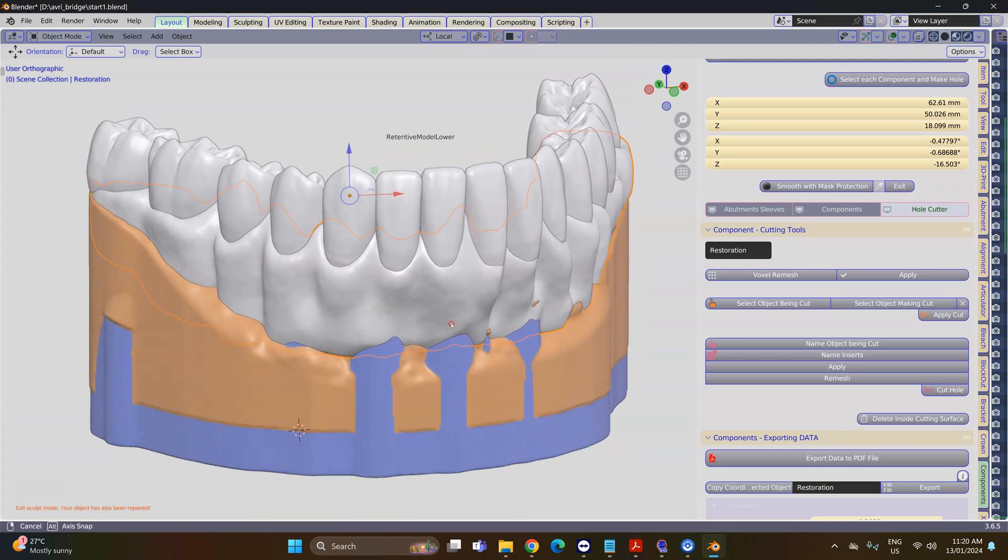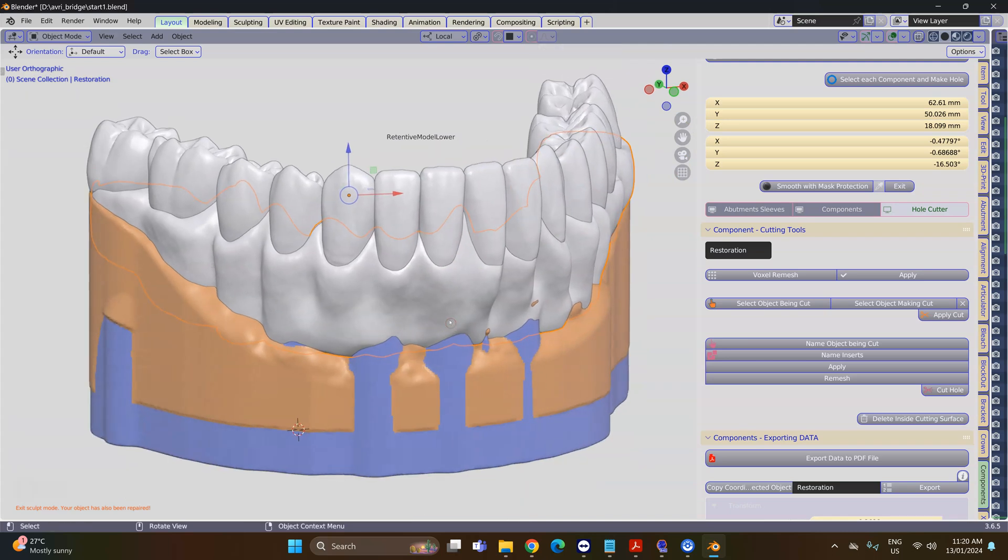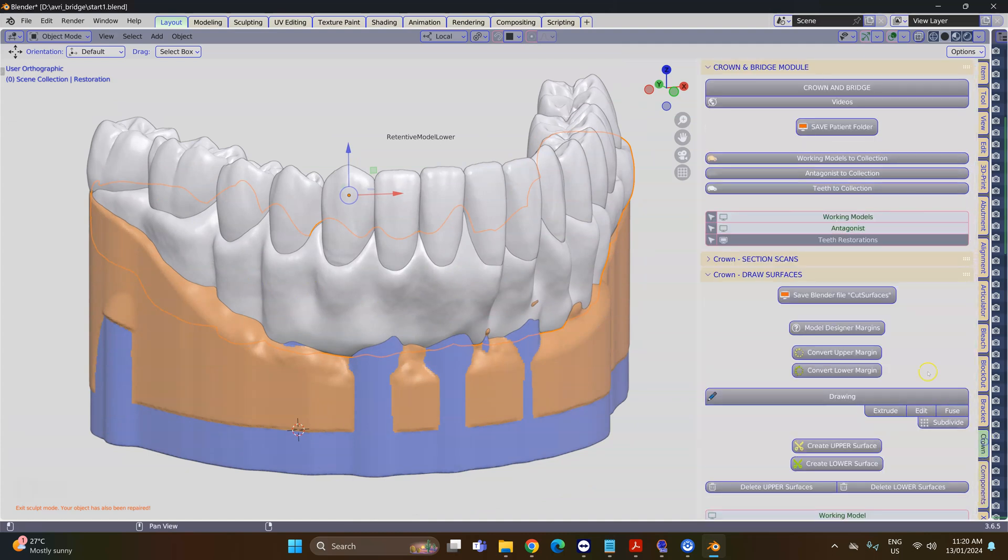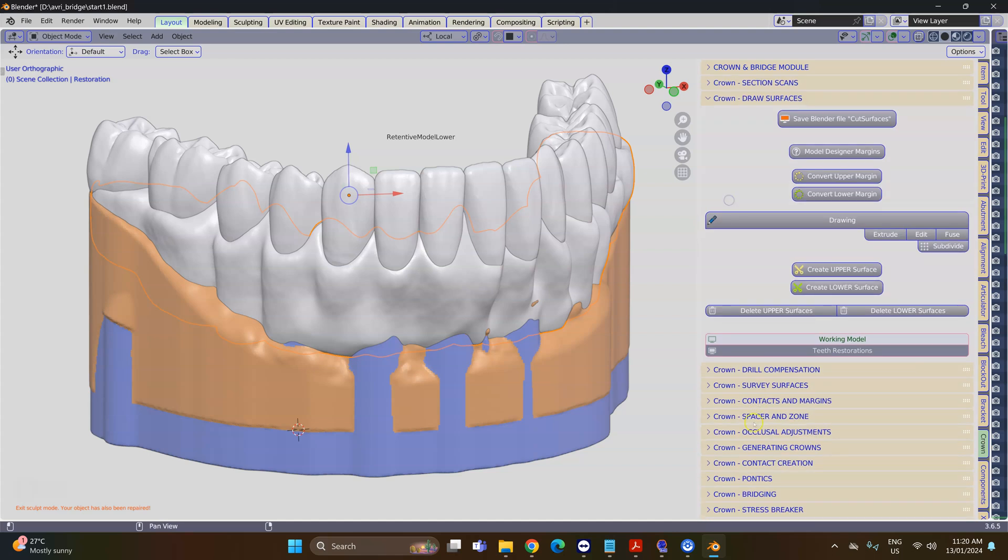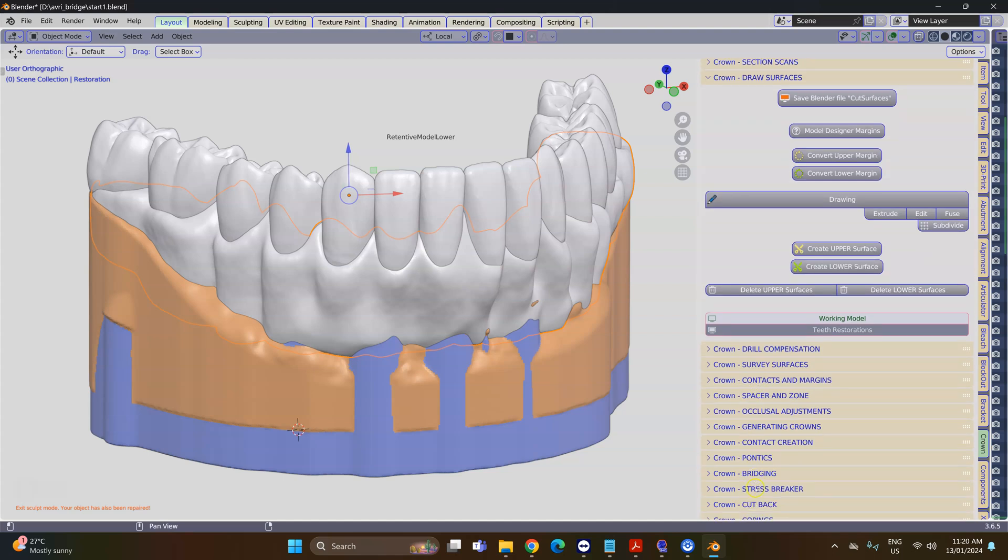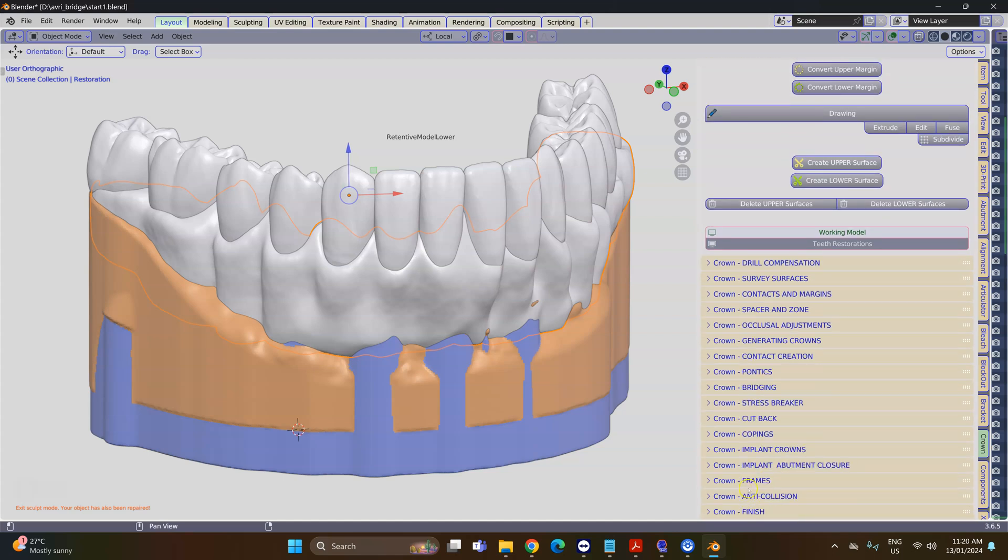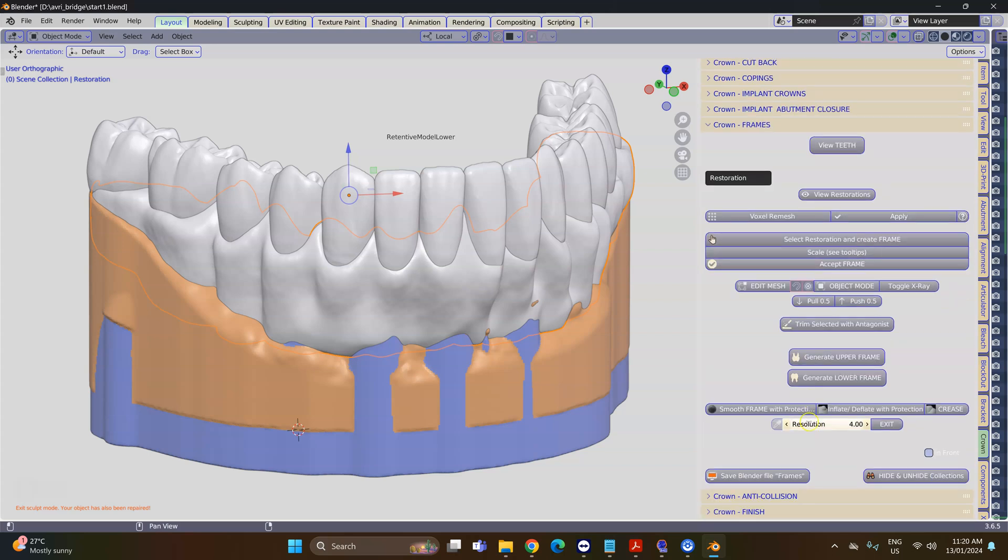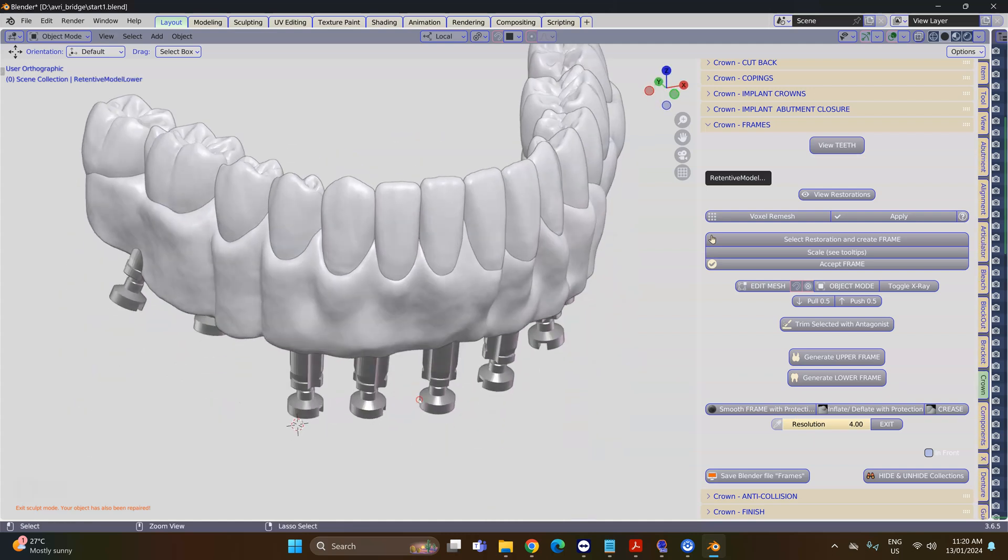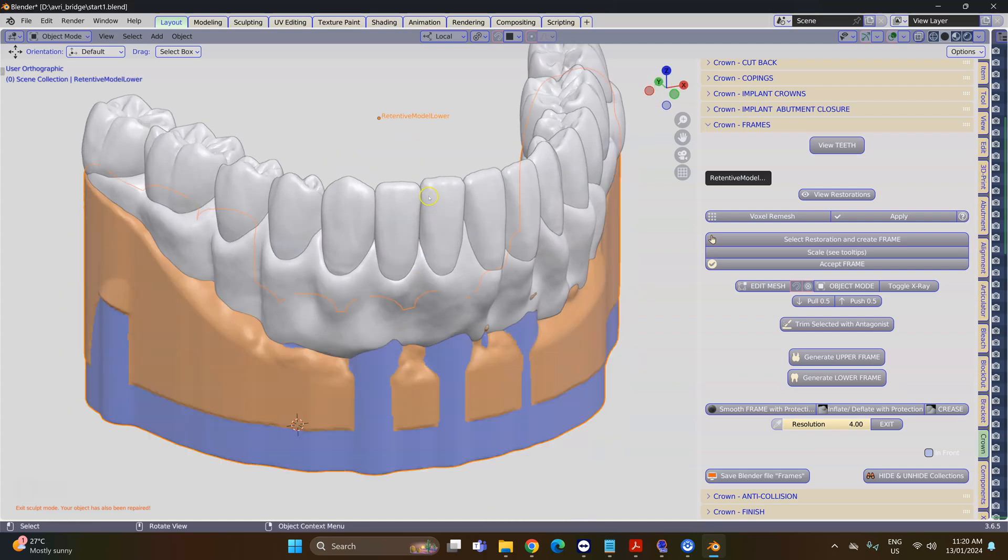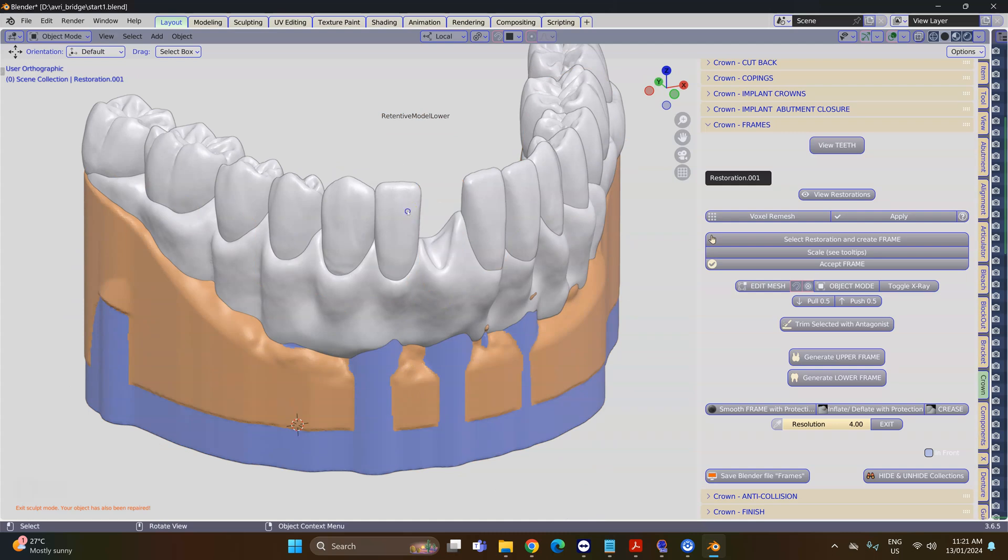The first thing we want to do is reduce the gum into a smaller version of this object. We're going to go to the Crown module and click on the Frames menu, then select the gum which again is protruding through the model and the teeth are protruding through the gum.